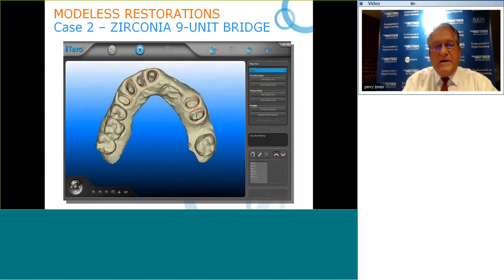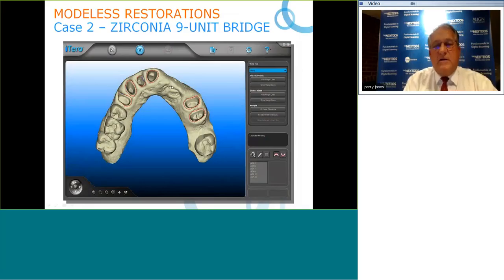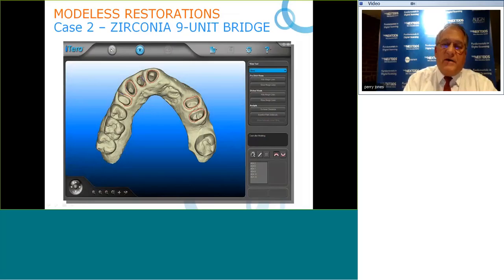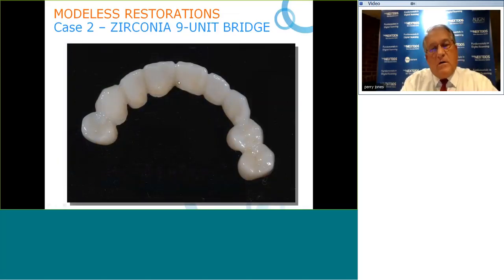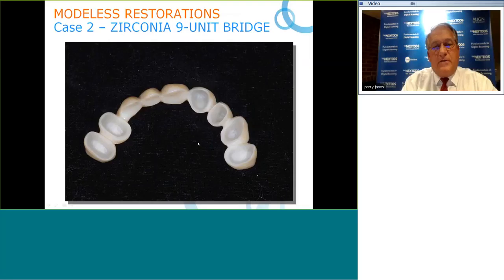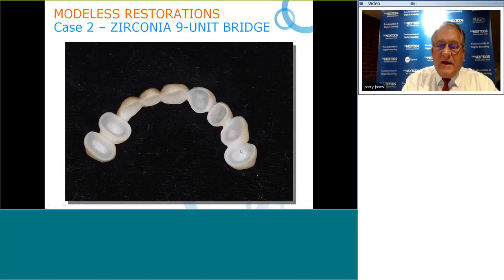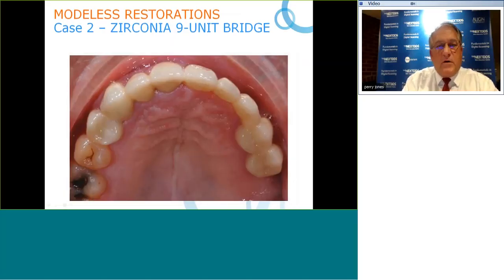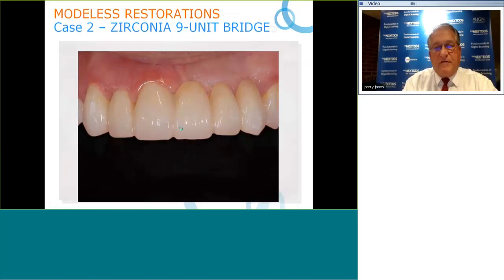The amount of bone loss in this patient made implants impossible to consider, so we're replacing his prior failed long span bridge with an all-zirconia restoration: a one-two-three-four-five-six-seven-eight-nine unit bridge. The intaglio surface shows this is a milled solid restoration. There was no occlusal adjustment necessary — a tight anterior coupled case — and here is the final restoration, showing the value of digital scanning in a 100% workflow.